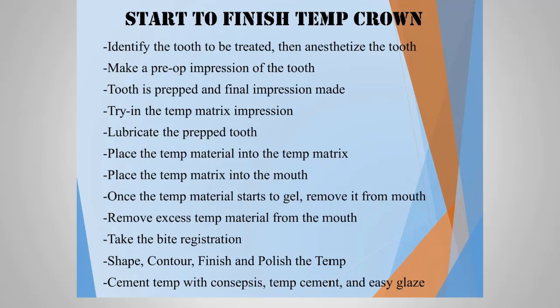Once I do that, I'm going back to the temporary that I've just made, taking my burs, reshaping, contouring it, finishing and polishing my temporary. And then the last thing I do is the cementation sequence, which is using the temporary cement, and then lastly the Easy Glaze.